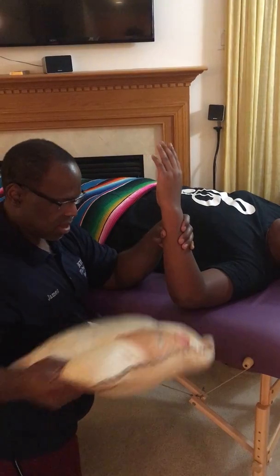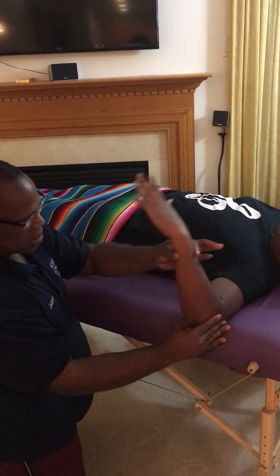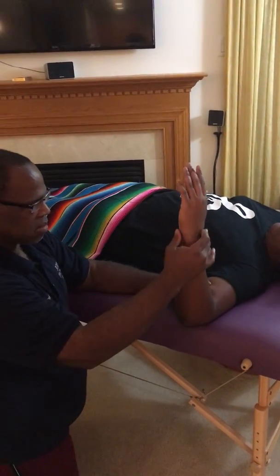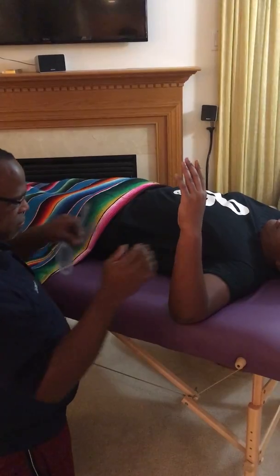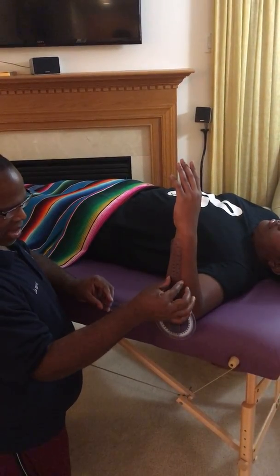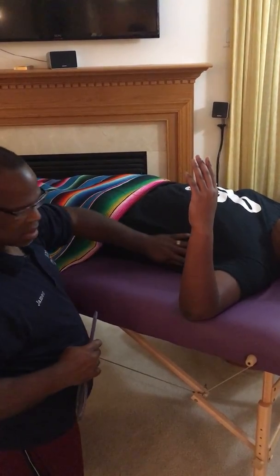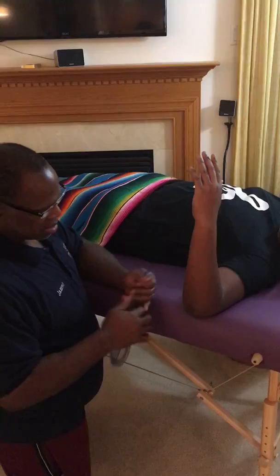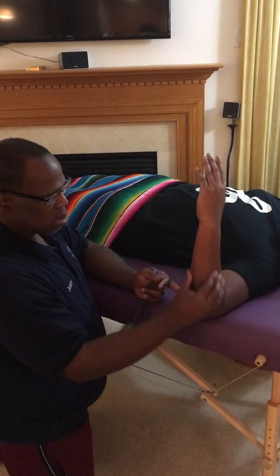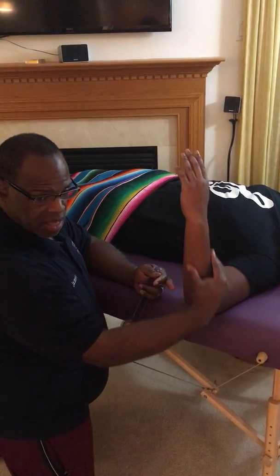I'm gonna take this out, okay? All right, so again, this is internal rotation, and this is external rotation. Now, the subject will hold their arm there. The goniometer will start at a 90-degree angle. Stationary arm is aligned with the trunk or the thorax. The axis is aligned with the olecranon, and the movable arm is aligned with the lateral aspect of the ulna.